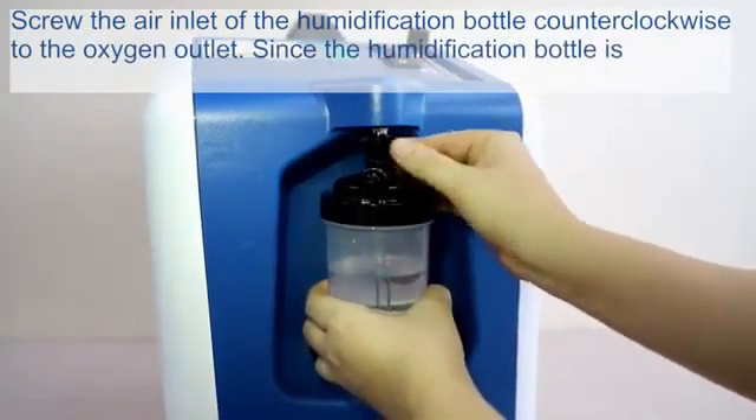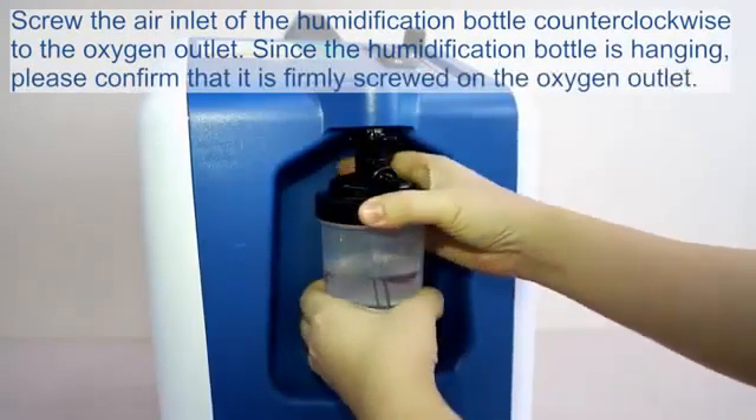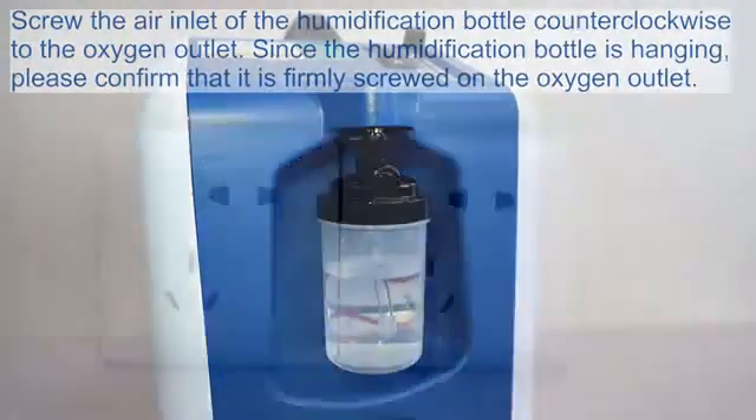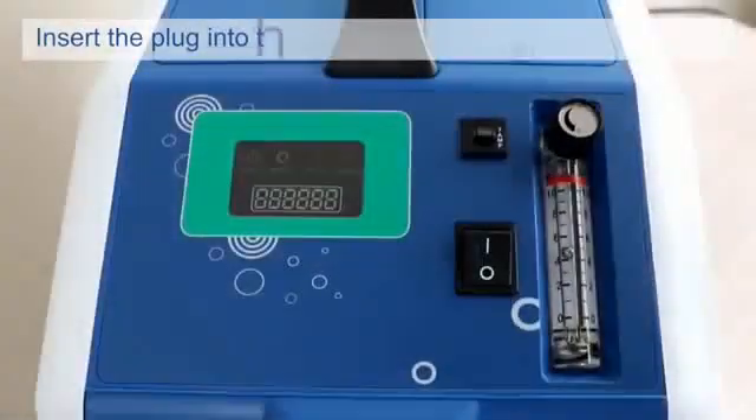Since the humidification bottle is hanging, please confirm that it is firmly screwed onto the oxygen outlet. Insert the plug into the power socket and turn on the power.